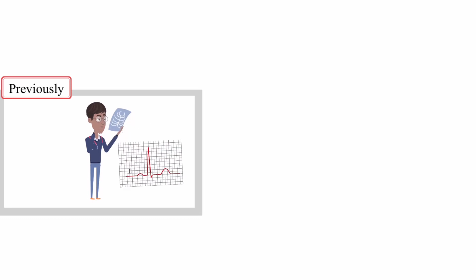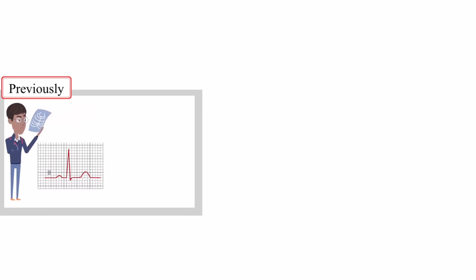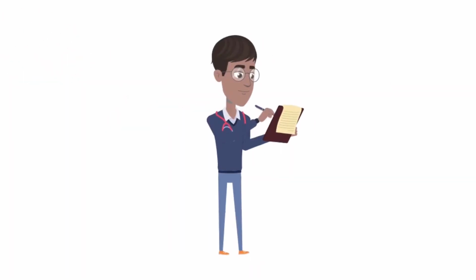In the last video, I shared some secrets on how to interpret the image captured. You can't fully appreciate the interpretation without talking about the values associated with the ECG paper and the image produced. Let us begin with the ECG paper.